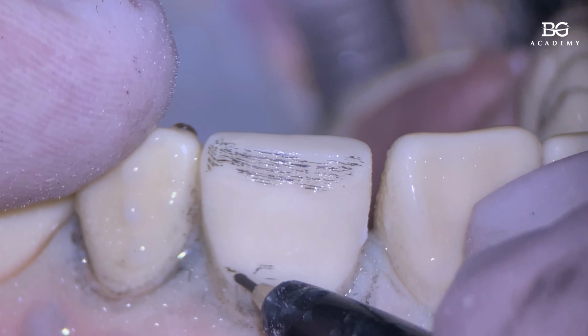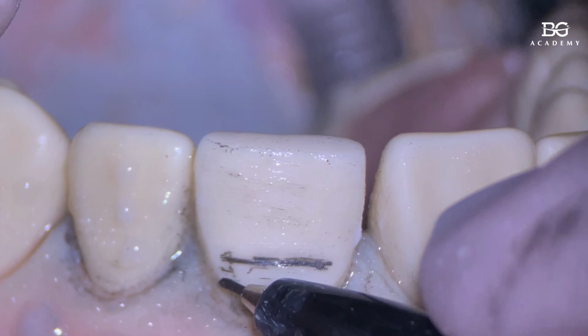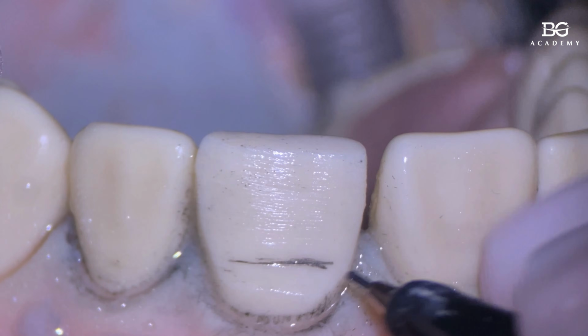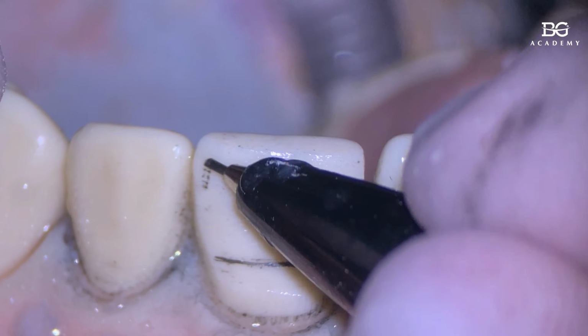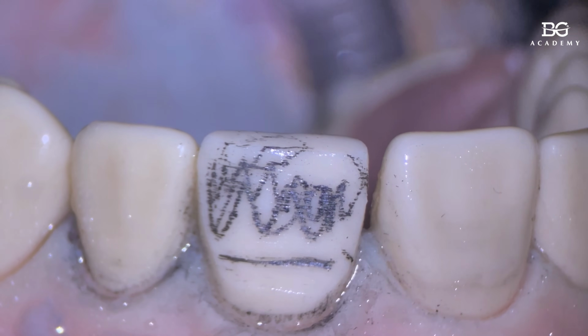Now let me remark the cervical. And now definitely I want to prep just here. Sorry. Yeah, I just want to prep this area. I don't want to prep all this. So that will be my cervical plane.